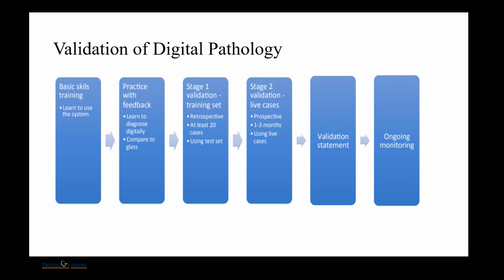Next, coming to validation of digital pathology. If you want to start digital pathology in your institute, you should have this validation system in place. This is the RCPath guidelines of best practice recommendations for implementing digital pathology. It starts with basic learning skills training. Second is to learn to diagnose digitally and also with glass slides, and compare it with glass.